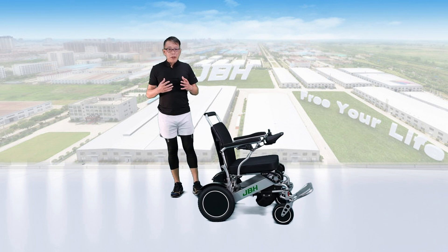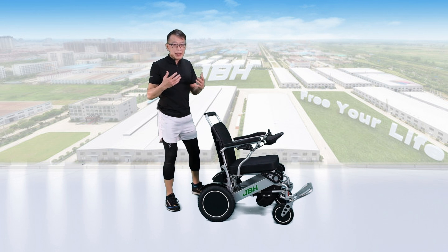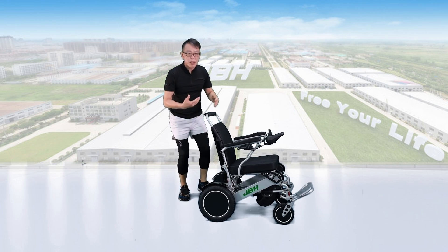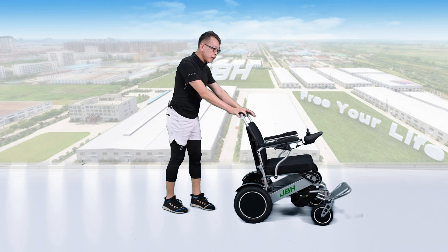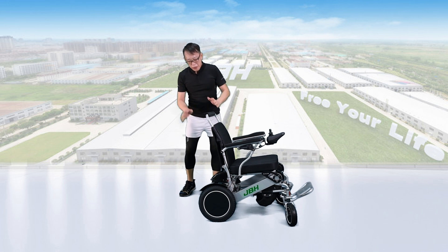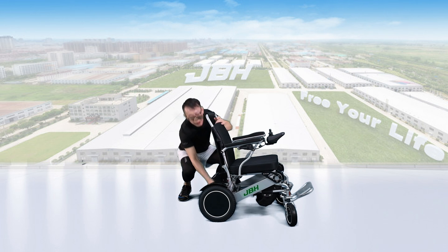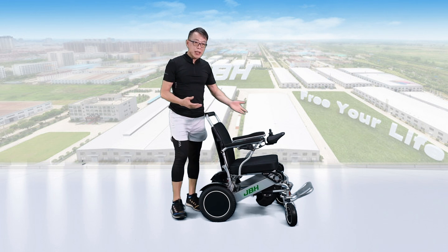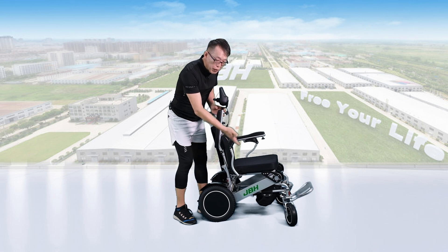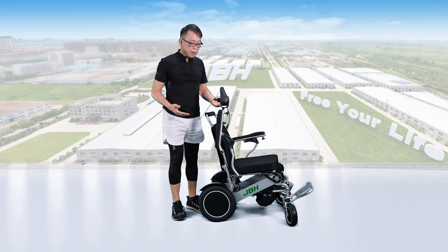The wheelchair has a free wheel mode design. If you want to push by hand, we need to keep the two levers on the back to the top — that allows you to push by hand. If you want to go electric, we need to push the two levers down. Then we can access the wheelchair either from the front or from the side. It's really simple and easy.